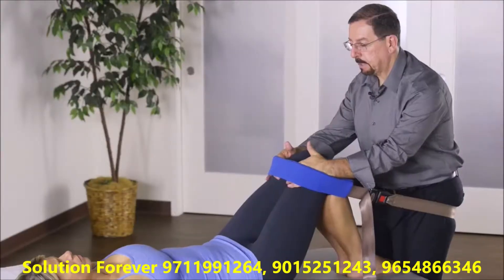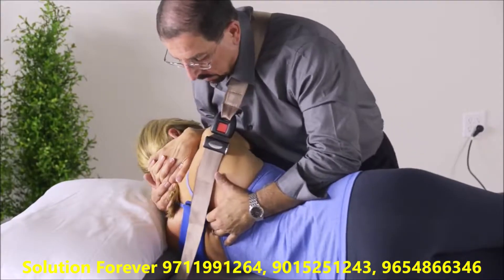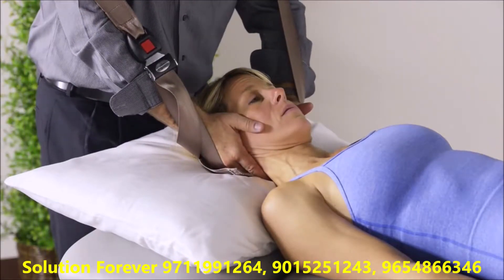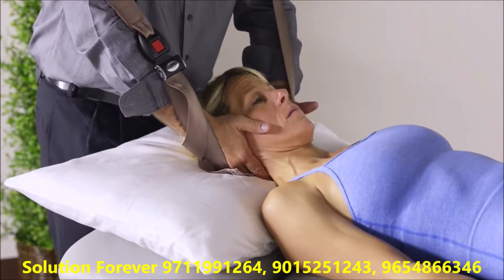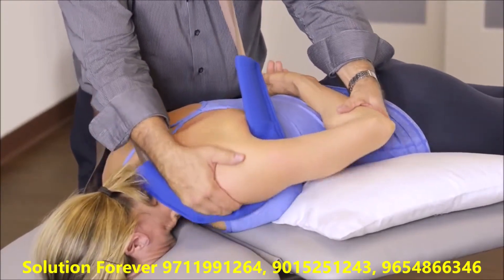The mobilization belt has proven to be a very valuable tool to help with supporting the patient's body, which minimizes the effort for the therapist to perform the technique. It also provides freedom to the therapist's hands by supporting the weight of the limb and the body while fine-tuning the techniques to the segment or to the limb they're trying to address.